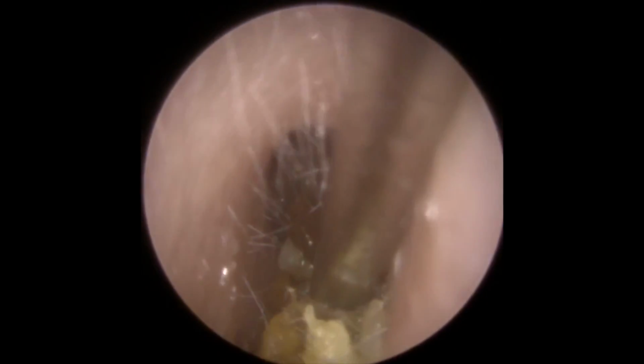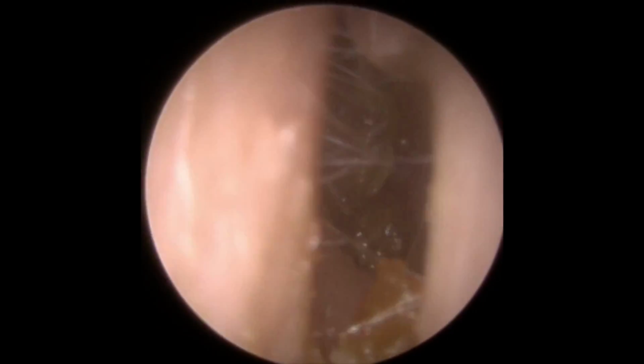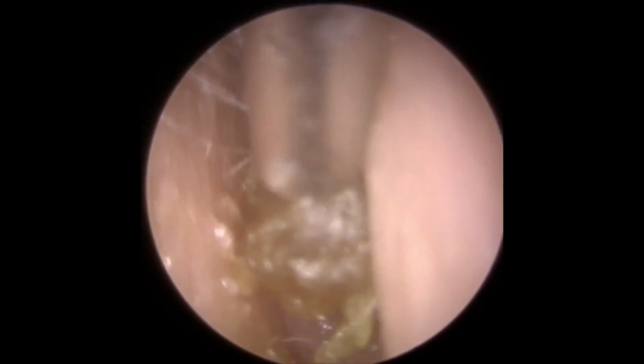Getting just behind that wax, bringing it down. You can see the length of that wax, the back end kicking up as you bring the front end down. There we go, brilliant. So we've got that front section away now. So we've got this back section here, which is just a collection of smaller pieces of wax. Still a bit on the large side to be able to get out of the canal. You can see really having to work this, wiggle it back and forth.